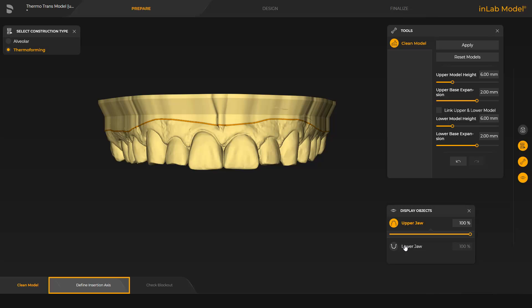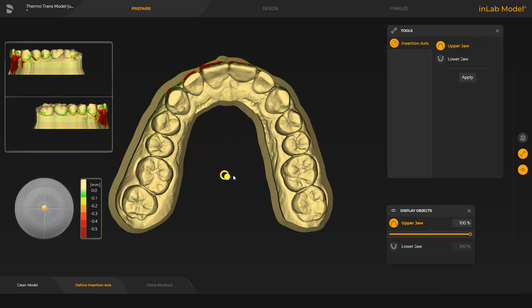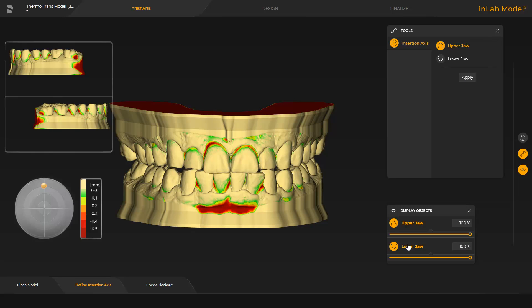In the Define Insertion Axis step, the axis for blocking out the jaw can be set. The undercut depth is visualized by a gradient, from light green indicating a low depth to dark red indicating a great depth. The insertion axis is displayed by the yellow arrow above the center of the jaw. It can be adjusted either by moving the arrow or with the disc and the orange colored ball at the left edge of the screen. By tapping Apply, the insertion axis is confirmed and we switch to the last step.